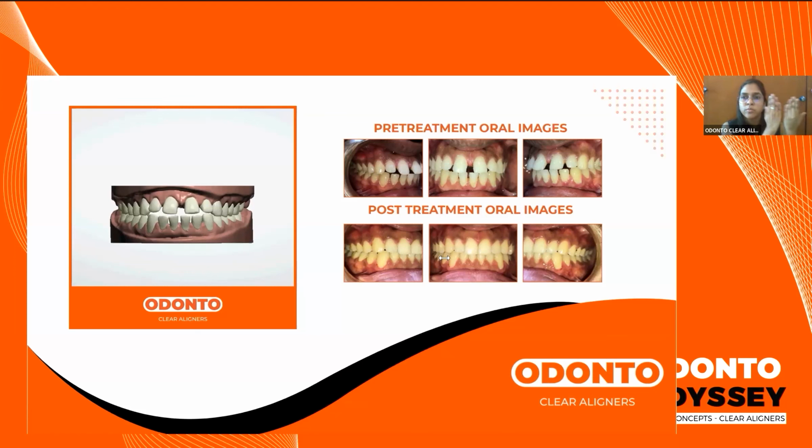The company is Strauss. There are multiple others which are available, but this is one of the better companies which provides the burrs, and you can invest in those. It always helps to invest in better quality proximal reduction instruments, because once you perform it, you cannot undo it. So it is better to invest in burrs which will help you to achieve the perfect amount of reduction, and you don't go wrong with it.